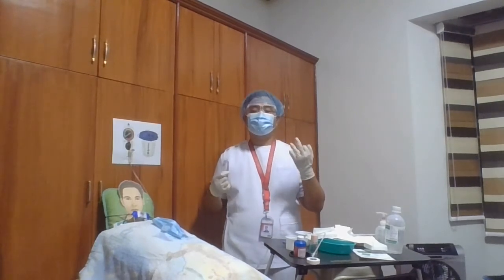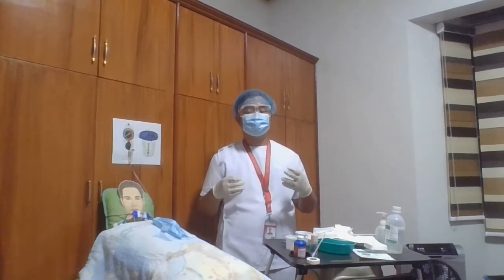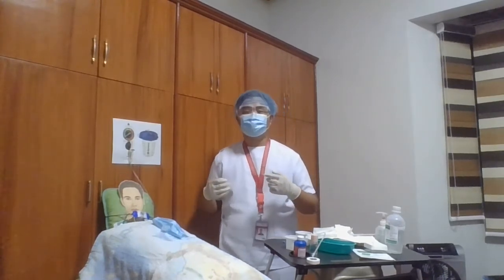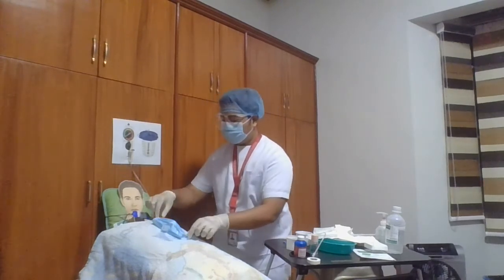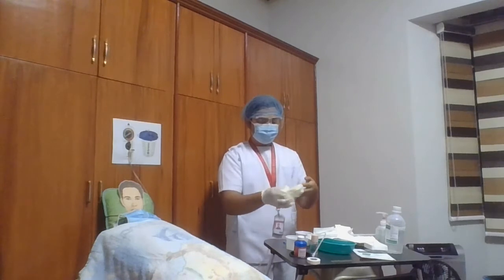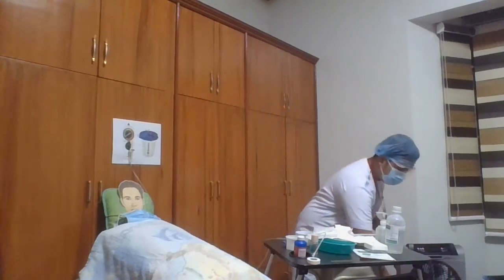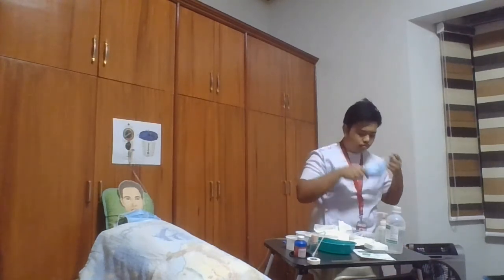We assess oxygen saturation using a pulse oximeter, with a normal measurement of 95% to 100%, and auscultate the lungs. Then we perform aftercare: replace the gauze dressing for our patient and bring back the oxygen supply if applicable. We need to provide privacy, then remove our protective equipment. Most importantly, we need to document the procedure and check the status of our patient. Thank you very much for watching, and God bless.